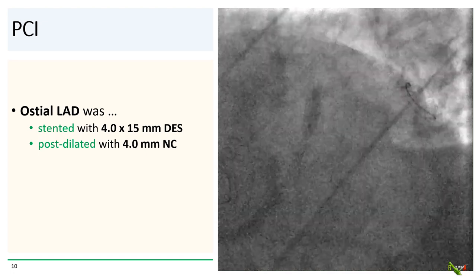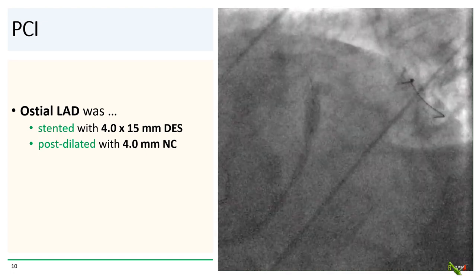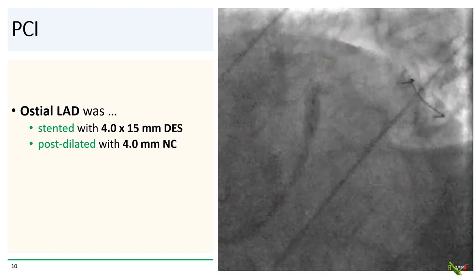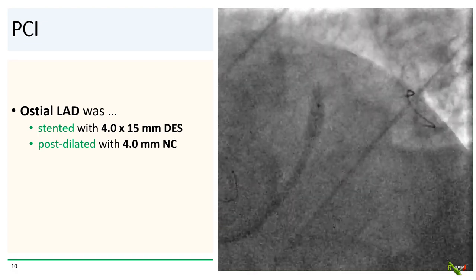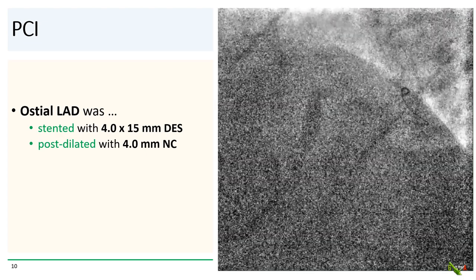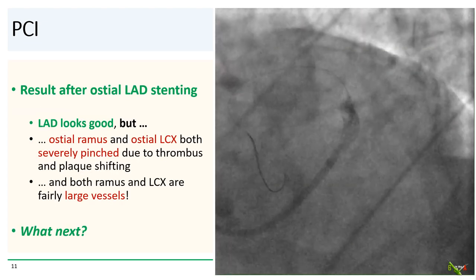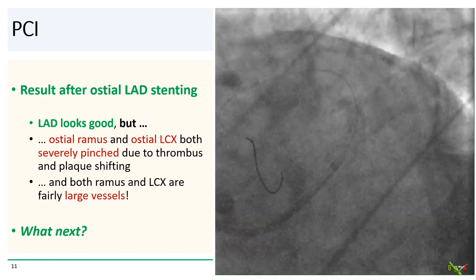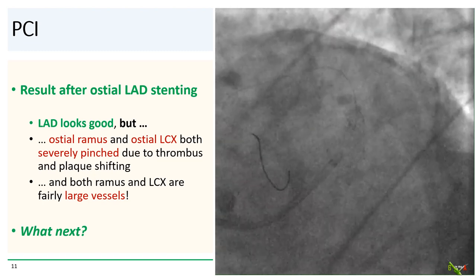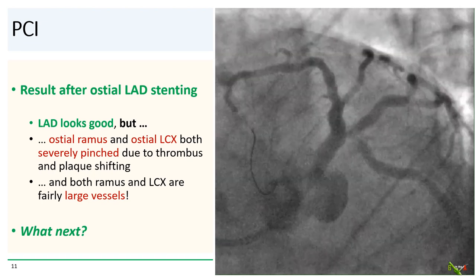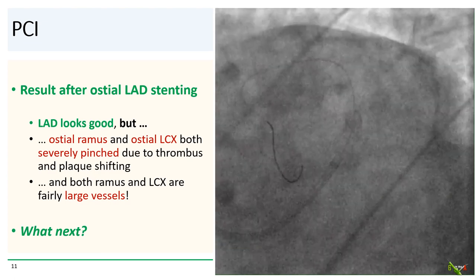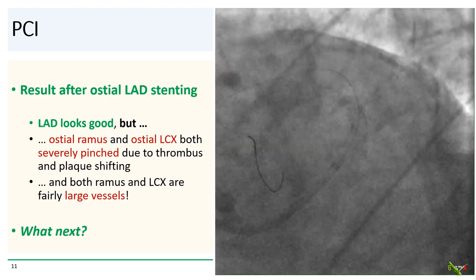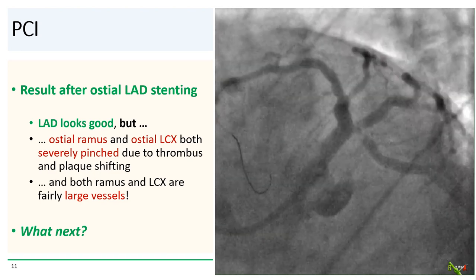So we stented the ostial LAD with a 4.0 by 15 millimeter drug-eluting stent, probably slightly protruding into the left main, and post-dilated with a 4.0 millimeter NC balloon. After stenting the LAD, the LAD looked great, but both the ostial ramus and the ostial circ were now severely pinched, probably due to thrombus and plaque shifting. Both the ramus and circ are quite large vessels, and remember the circ is dominant.